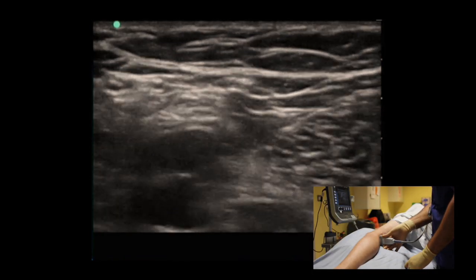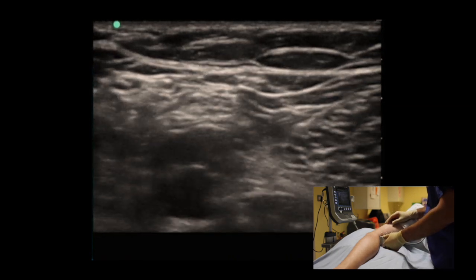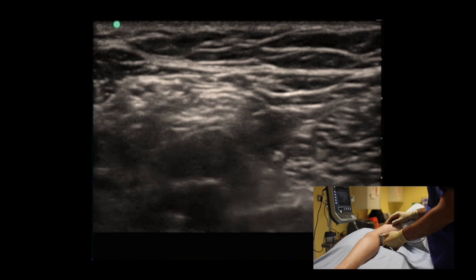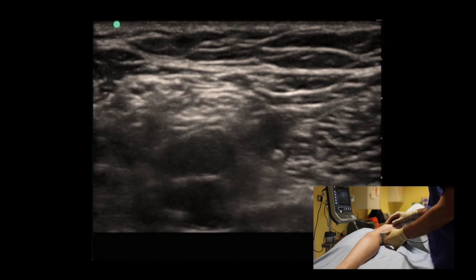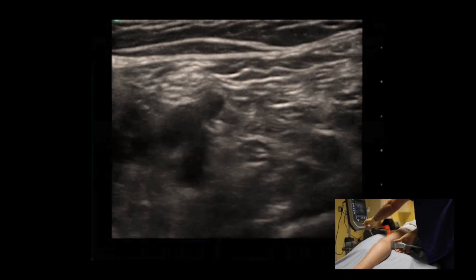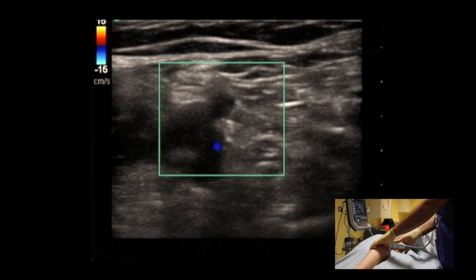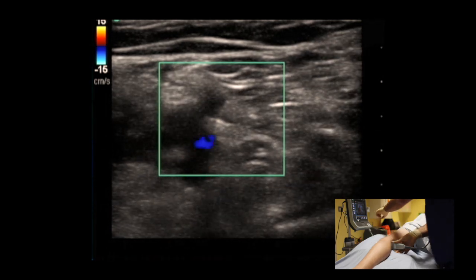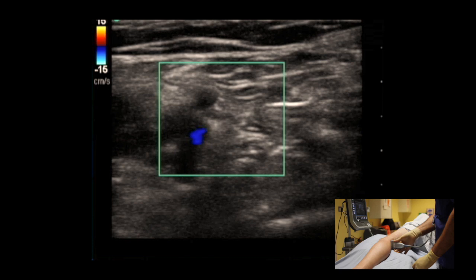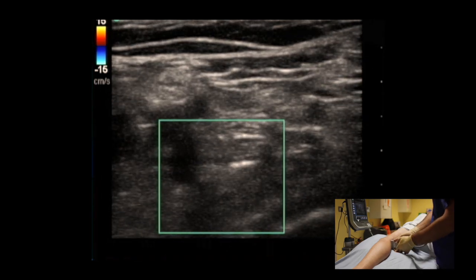Below the tibial nerve, you can see the popliteal vein and the popliteal artery. With gentle probe pressure, the popliteal vein is compressed while the popliteal artery remains patent and pulsatile. By applying the colour Doppler and squeezing the calf, the venous return through the popliteal vein is seen to increase with the blue flow demonstrated thus. The popliteal artery is seen here in red, pulsatile and non-compressible.